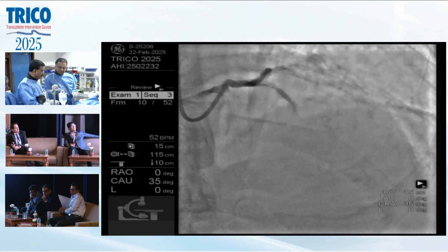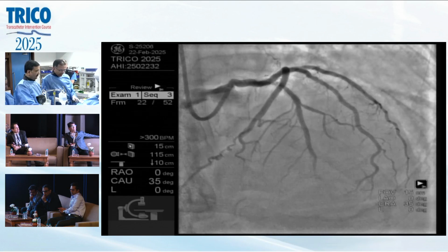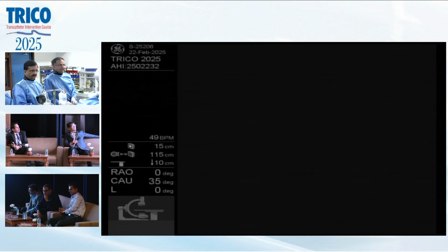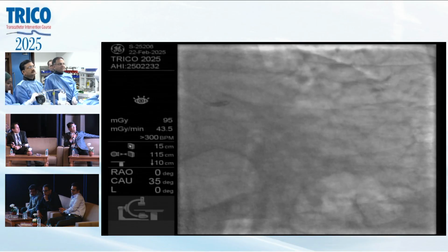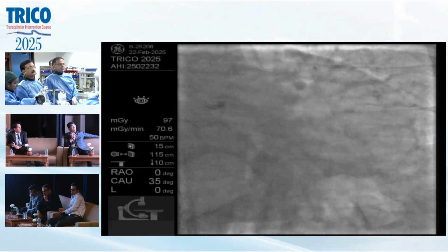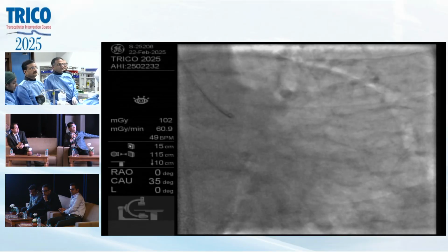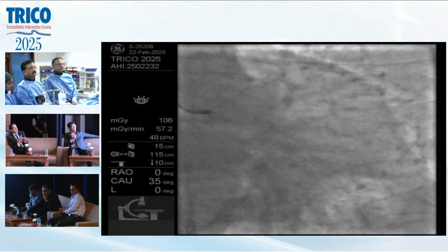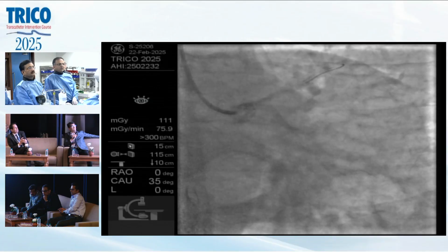It certainly would not be neointimal hyperplasia this far out. So you would say the same as a native atherosclerosis? Yes, with an added limitation of the stent restricting your adventitia or the media. So it's actually a little more difficult than the average stenosis like this in a de novo vessel. I guess the only unusual thing is the presentation was a non-STEMI and not stable angina. Okay, let's go cranial.